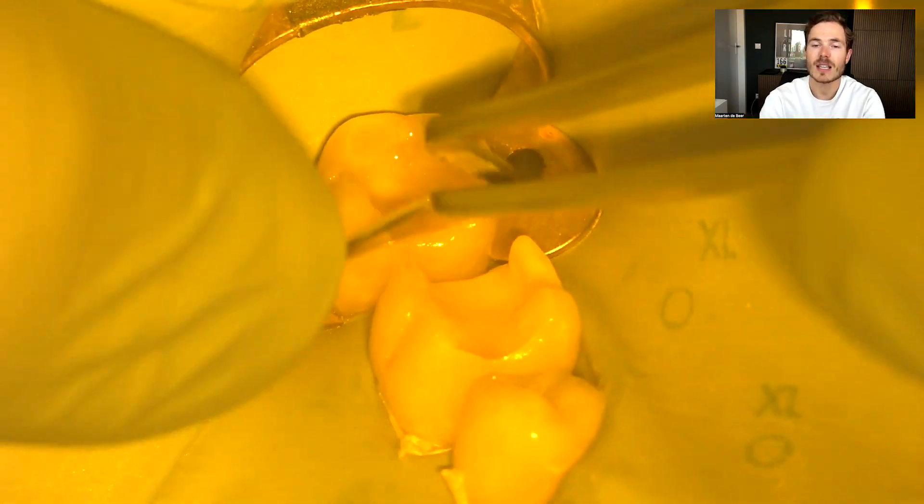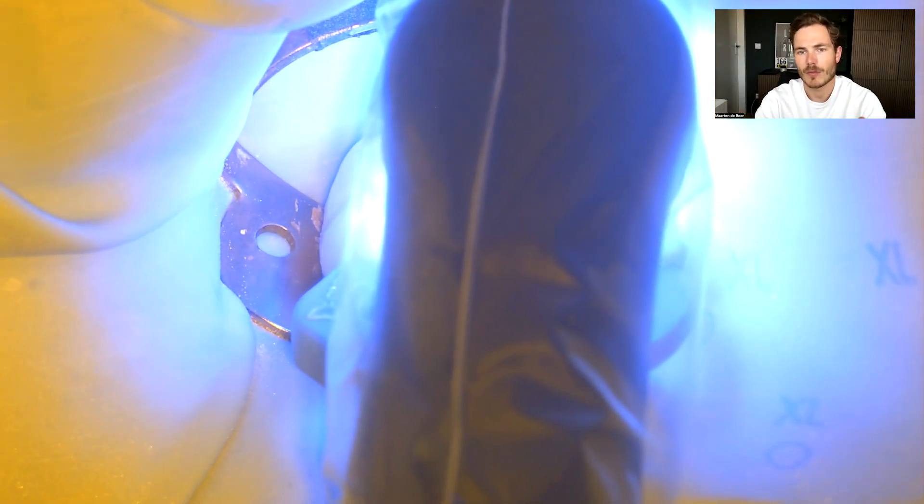I can now continue with removing the band, the wedge, and the ring. We see that we have a really nice contact point with a nice shape, and then we can continue to the distal side of the first molar. As I said, we always want to go back to a class one, so we restore any missing walls before proceeding to the occlusal part. I repeat the same steps with the Condensa making sure the wall is really thin, then use the Fissura at a 45-degree angle for a nice rounded marginal ridge, then the brush to make everything super smooth, light cure, and remove the band.